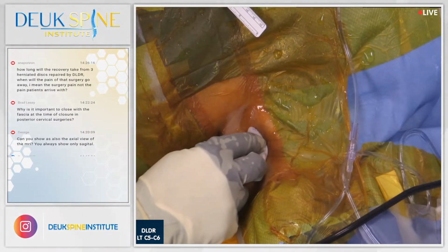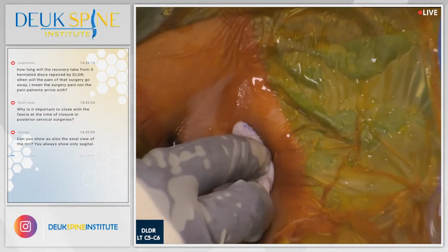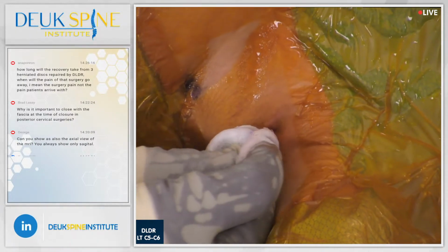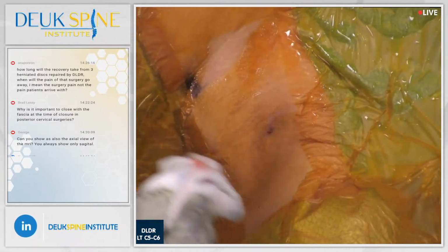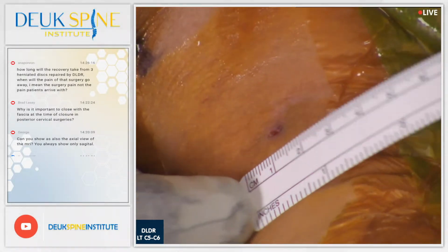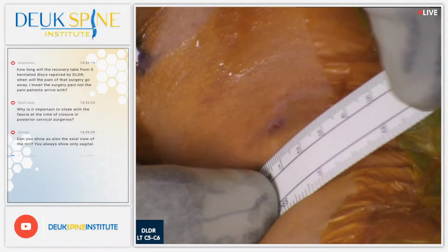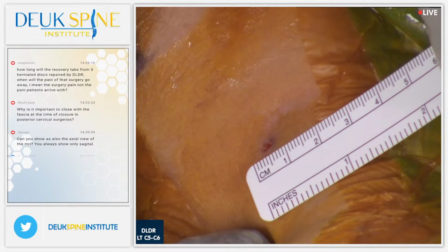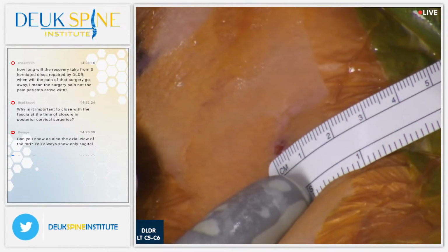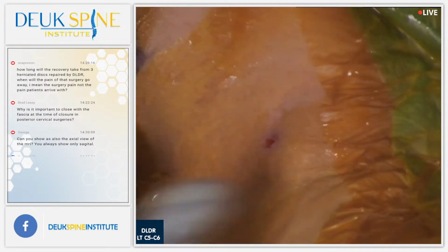The incision is 4 millimeters. You guys have a ruler here. Let's just see if it's bleeding or not. I don't see any bleeding. So it looks like she had a meeting with a vampire that had one tooth. You guys see this? Yes, we do. Can you see that 4 millimeter incision? Yes, sir. All right, 4 millimeters.